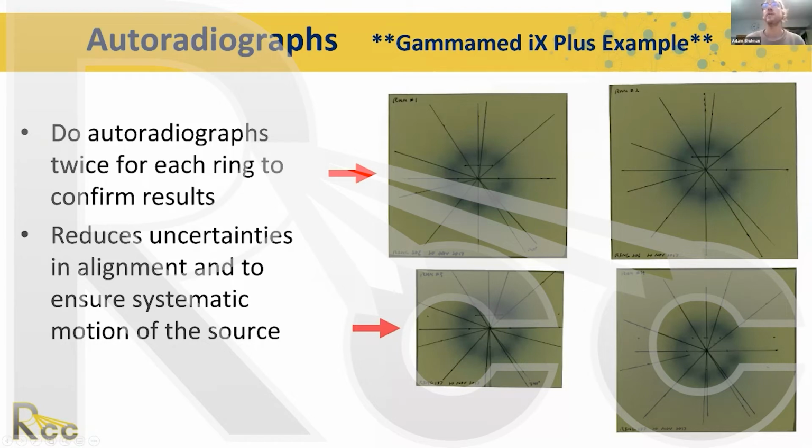Yeah, sure. So it's probably different between different vendors, exactly what it's made of, but most of the time, at least the external physical properties should be very similar. So the length of the encapsulation should be the same. The weld should be the same to the cable, and the cable should be the same. So it should behave either identically or extremely similar to the active source. And that's the main thing that we're worried about, is just that it behaves the same as it travels through the ring.